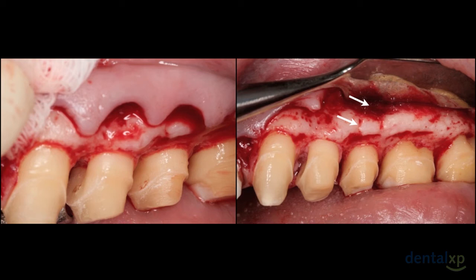What I suggest is before you start any incisions, you take your finger and feel the thickness of the buccal bone. If it is thick, you know that a full thickness flap must be started, and if it's very thin, you could do a split thickness flap if you want all the way down. However, sometimes it's best just simply to do a full thickness flap and then a split thickness flap so you can do any osseous contour you want.